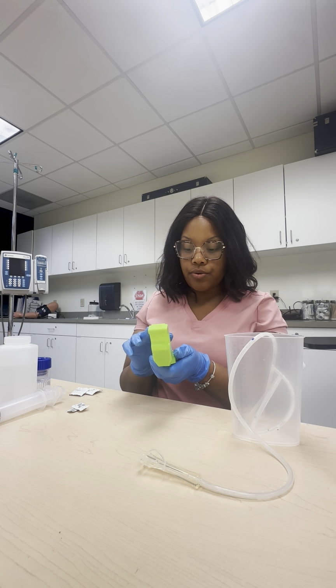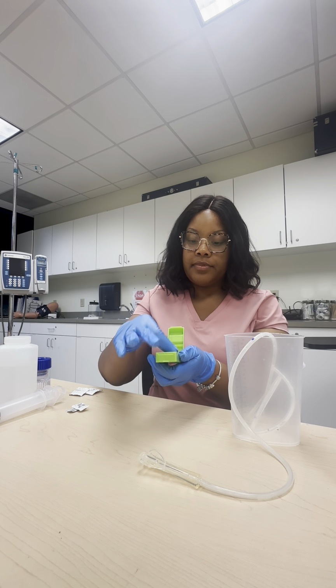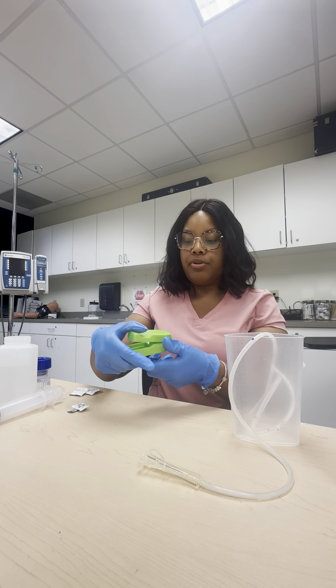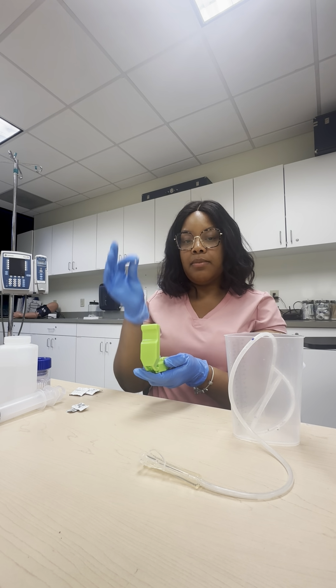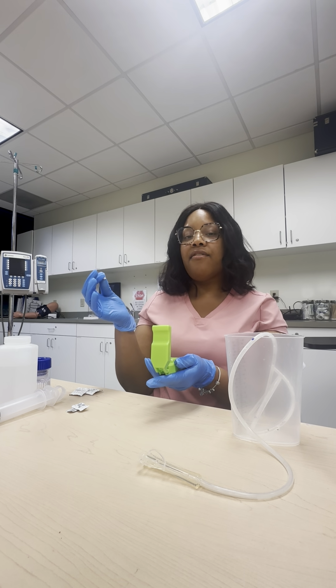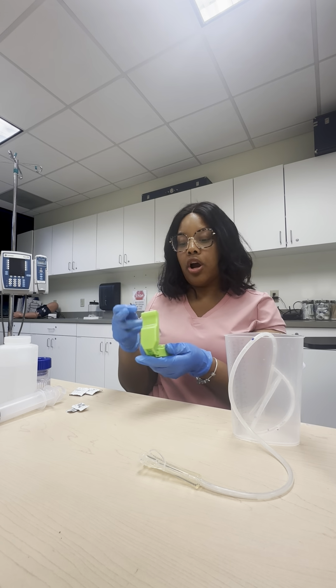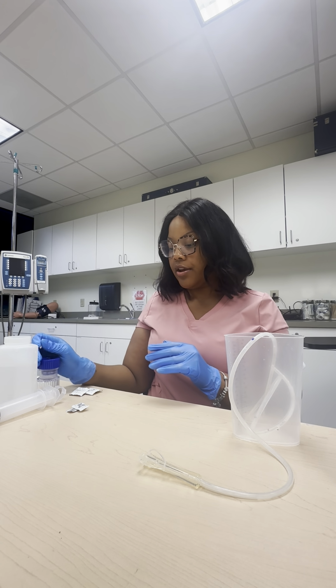And all you're going to do is line up the line. Slid out. All you're going to do is line it up. All right, so then press down. And it then split the medication in half. So the other half I would put in the trash, or I will put it in the sharps. All right, so this is one half right here.